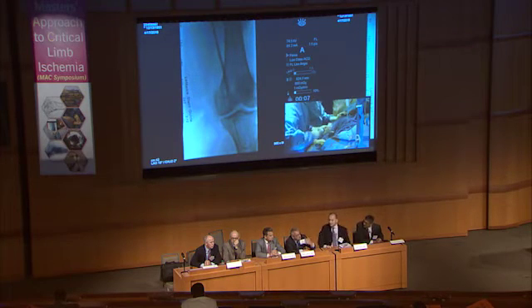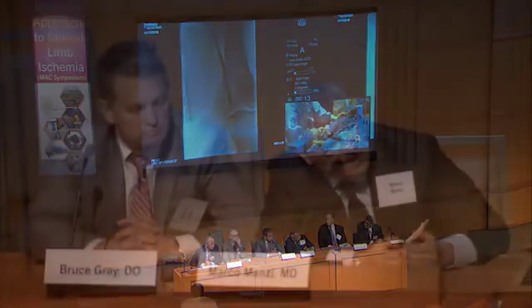Maybe I'm wrong, but if we open up and we give a better outflow to the SFA, the blood pressure into the SFA should be less, and probably even the potential residual communication will disappear. The problem is the main flow is from the profunda. So a new distribution of the blood flow pressure with a good outflow could really influence the performance of the fistula. So Bruce, Thomas, Suresh, and John.